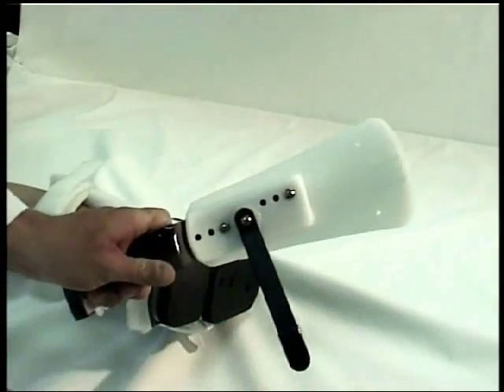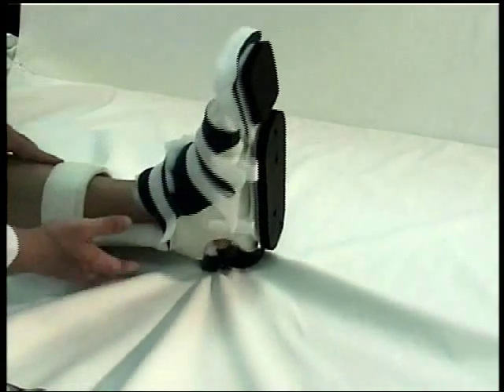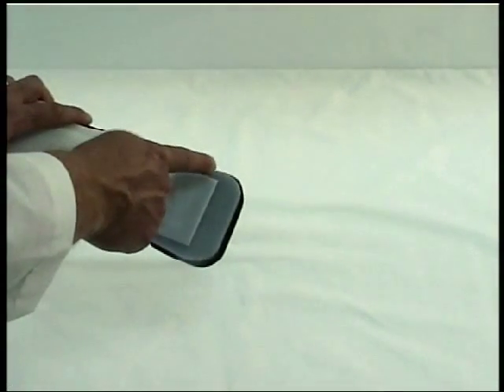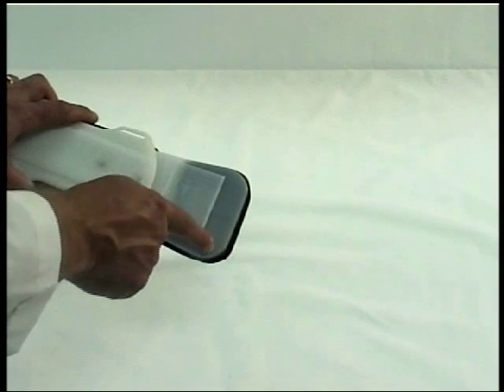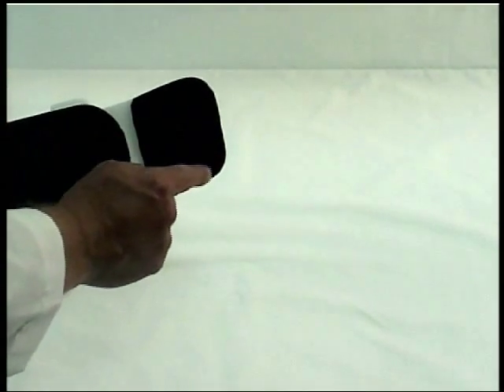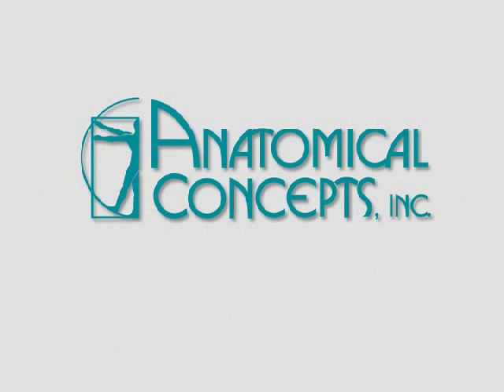Once you are finished fitting the orthosis, carefully inspect the position of the patient's heel to ensure there is no contact with the superstructure. Also for the walking base, if necessary, the polypropylene toe extension can be trimmed just beyond the distal end of the toes in a manner normally employed by those trained in the art of thermoplastic orthotics. You have now successfully completed the custom fitting of Anatomical Concept Incorporated's PRAFO APU orthosis.